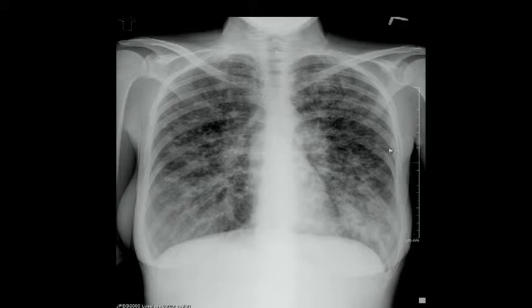The second thing is, if you're calling them multiple bilateral, bilaterally symmetric opacities, that's not enough. Are these interstitial or are these airspace? We need to identify that right off. So would you say there are more cotton wool appearing opacities or are there more lines and crisscross? How would you describe them? Would it be like cotton woolly opacities? This one would definitely, this larger one here, and that would be more of an airspace, I think. Airspace. So I would also convince myself saying these are airspace opacities, less likely to be reticular opacities, number one.